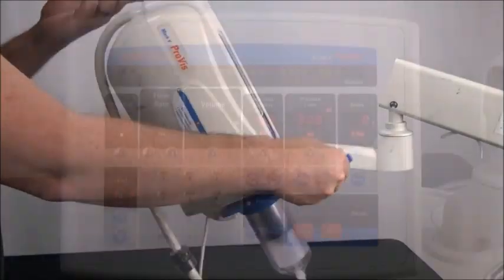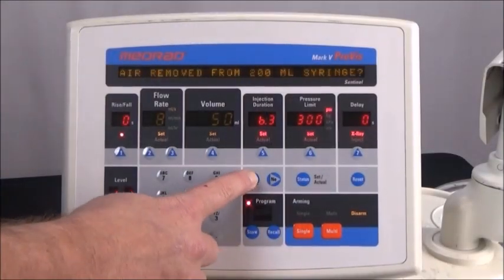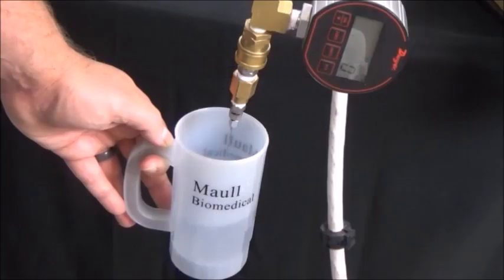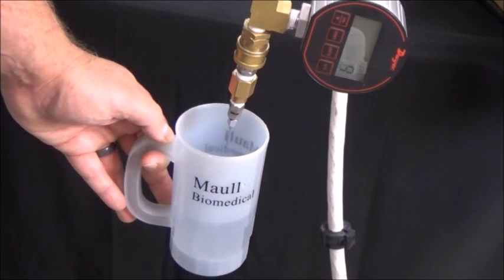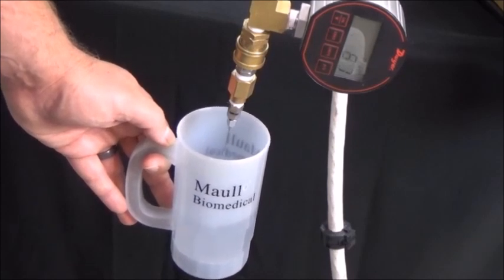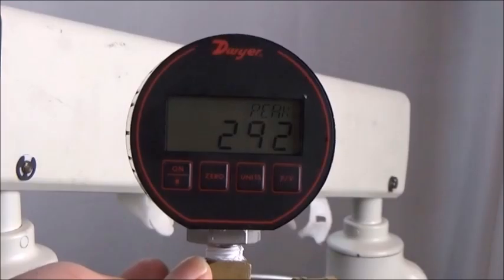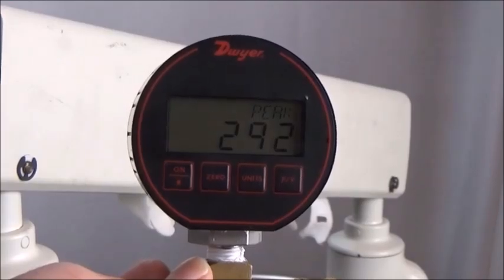Tilt the injector head down, single arm the injector and inject, allowing the full injection to complete. Shoot the injection directly into a container, being careful not to bend the needle or let the stream of water hit your hand. When the injection is complete, record the peak psi reached on the pressure gauge during the injection.